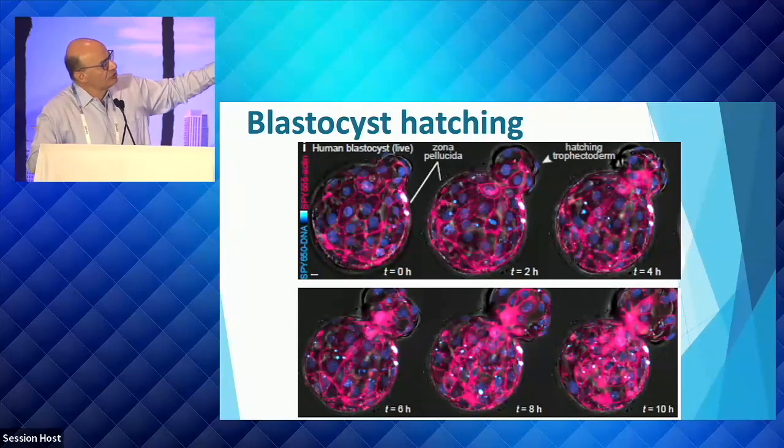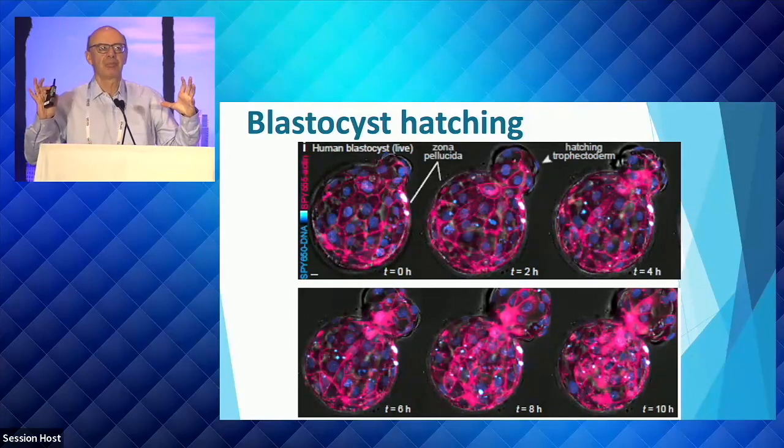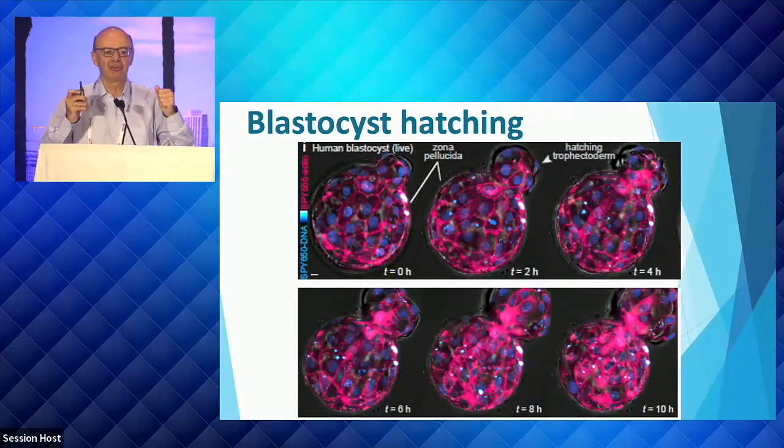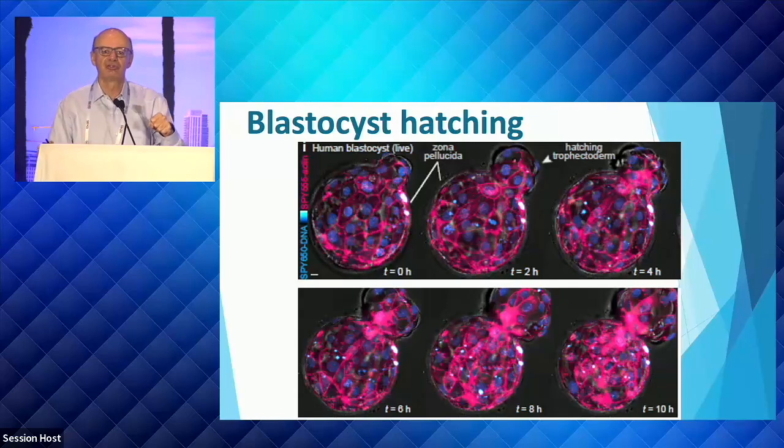And we can do time lapse of blastocyst hatching. We see an amazing concert of activity to push out of the zona, and how important the shape of cells is at the trophectoderm, and how important the actin is in pressurizing the zona pellucida to help the embryo hatch out.